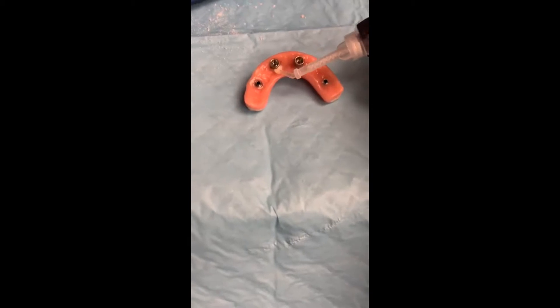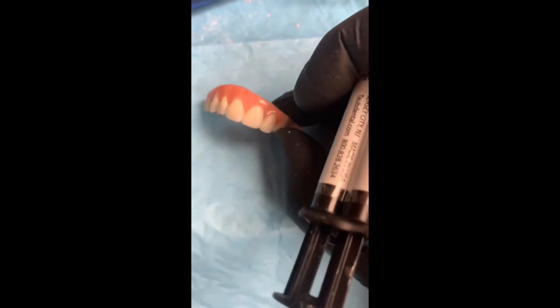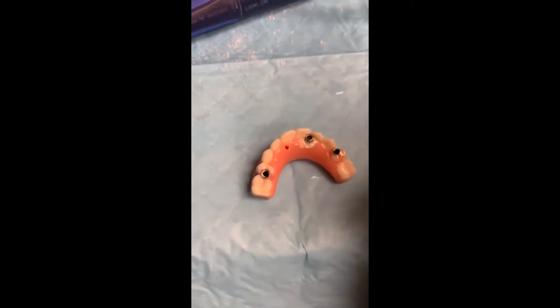So here we go — we took the Nobel implant out of site number 11 and placed a Straumann BLX implant. Right here, what we used for the pickup was the top white, because it's really close to the facial aspect of the teeth. So I didn't want any of the pink showing through, so we did that in white.